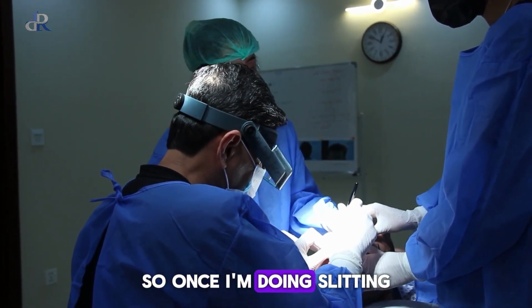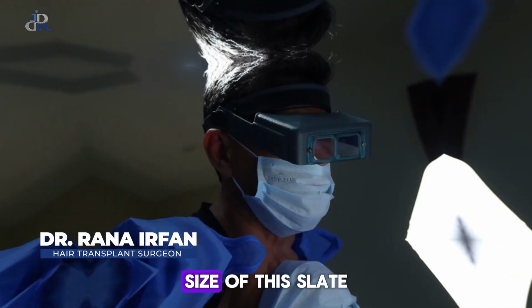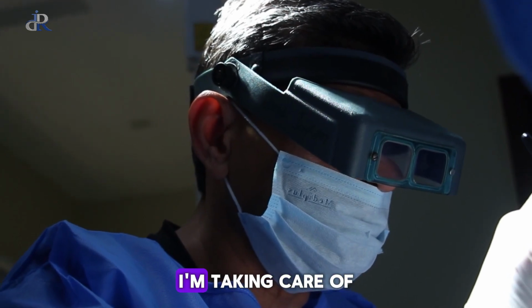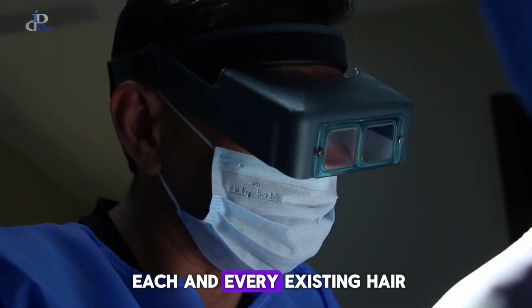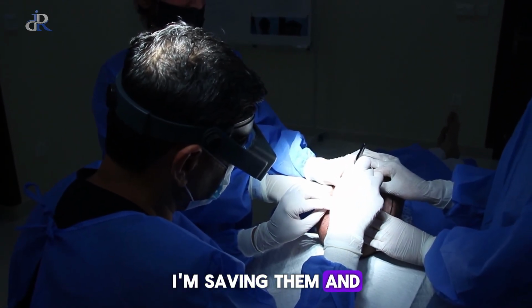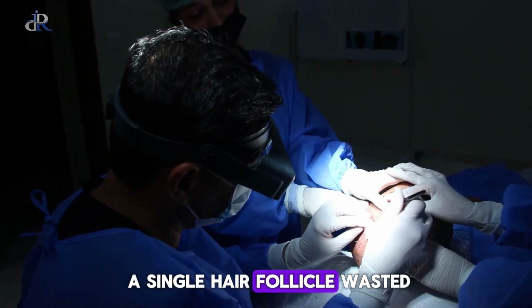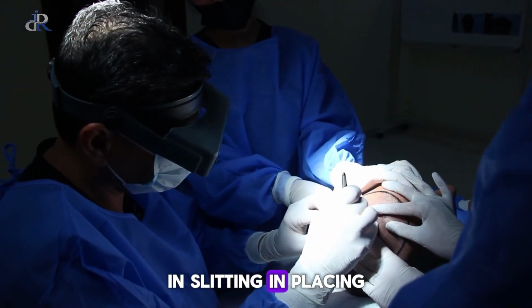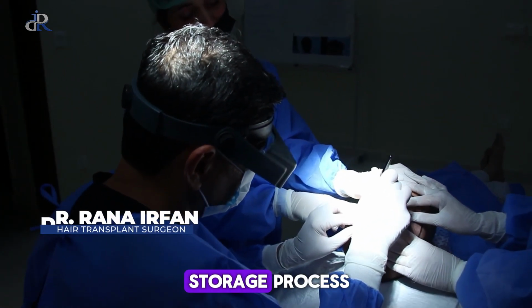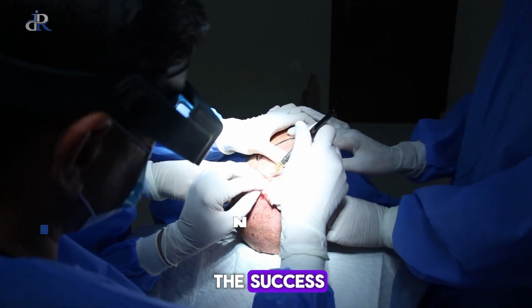So once I'm doing slitting, I'm taking care of the depth of the slit and the size of the slit to get the new follicle to fit in. And I'm taking care of each and every existing hair in this area. I'm saving them, and in my office, you will never see a single hair follicle wasted in slitting, in placing, in excision of the graft from the donor area, and even in the storage process. So this is the whole story behind the success.